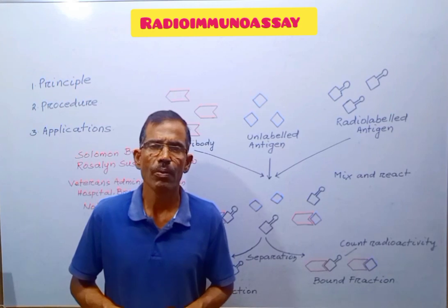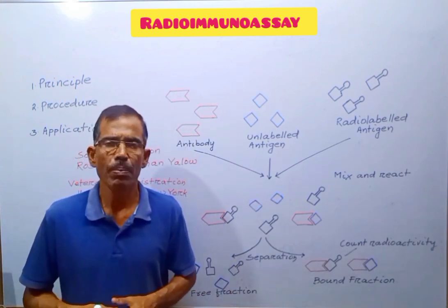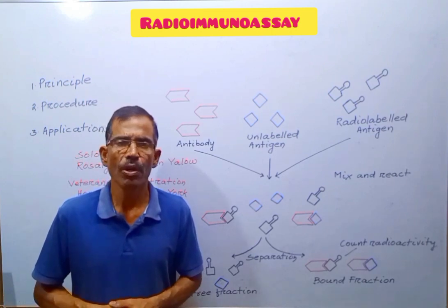Friends, today we shall discuss the principle, procedure and applications of radioimmunoassay.